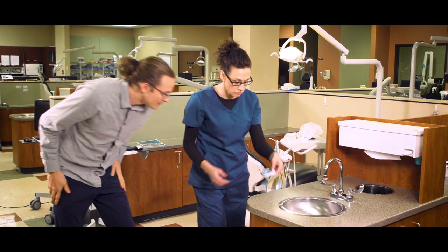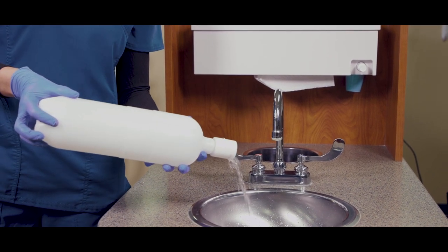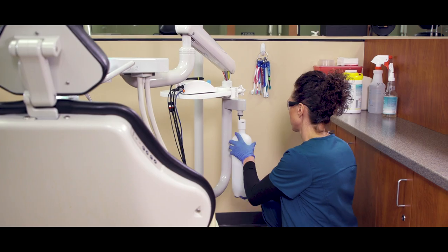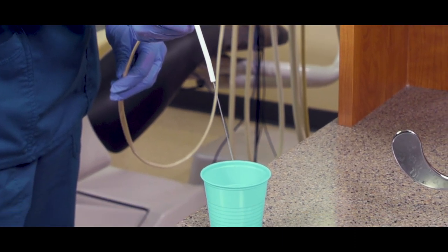All right, 10 minutes is up — you're ready to finish the process. Detach your bottle and pour the remaining solution into the sink. Never put it down your evacuation lines. Add warm tap water to your bottle and flush each line for about two minutes, getting all the bacteria and bleach out of the line.